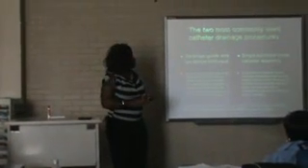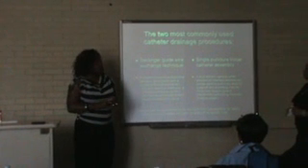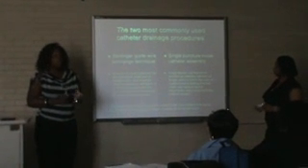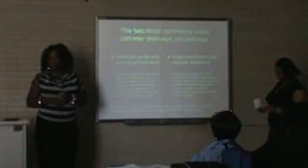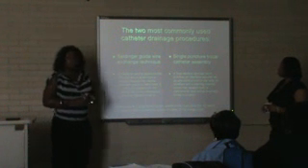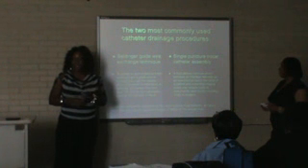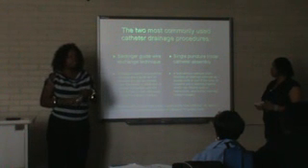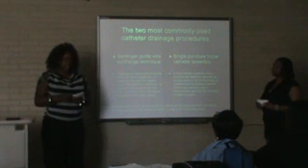You also have your trocar catheter assembly, which is basically a fluid delivery cannula that offers an interface between the access point of the patient and our working channel. Catheters are usually selected based on the volume of the fluid, the viscosity, the nature, and the margin of safety of the access route.